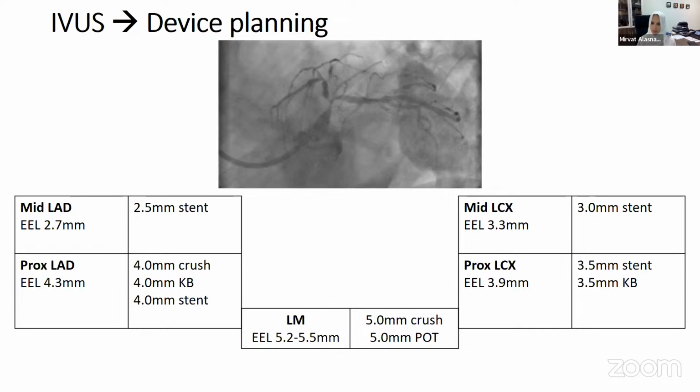I don't think that's the purpose behind or the mechanism for drug-coated balloon. It's the coating rather than the pressures that you go up with. Just like IVL, it's not really the pressure that you go up with the IVL, we go 4 or 6 bar. It's really the shock waves that end up penetrating and modifying the calcium.